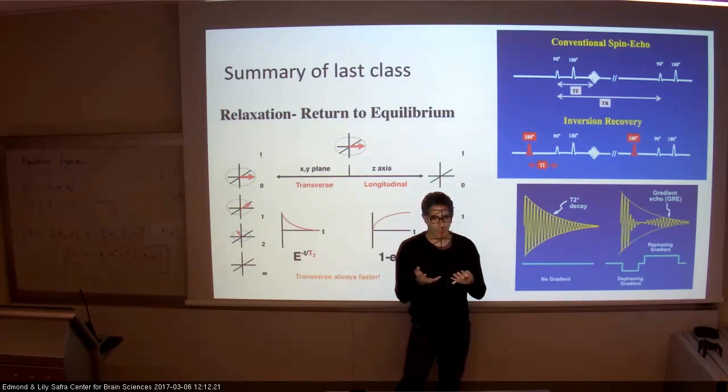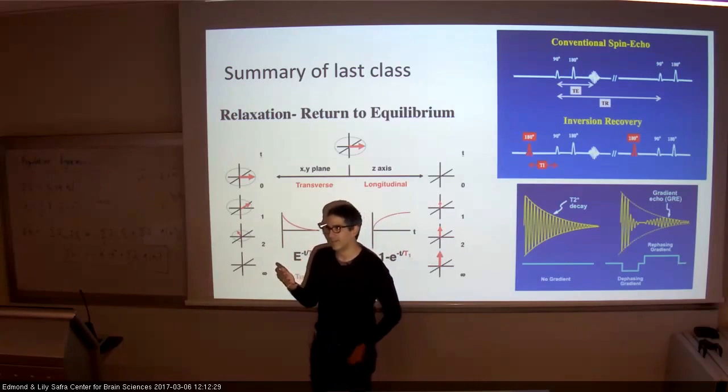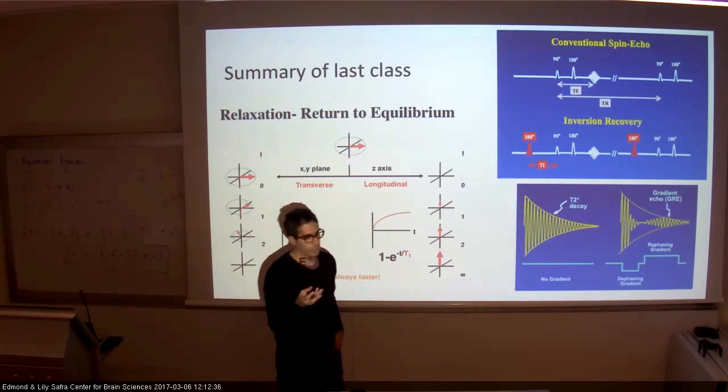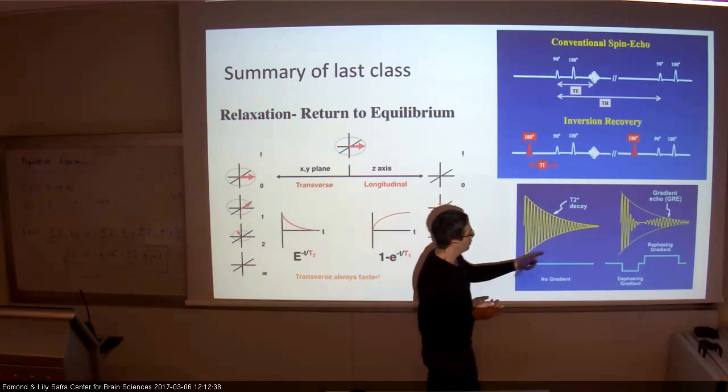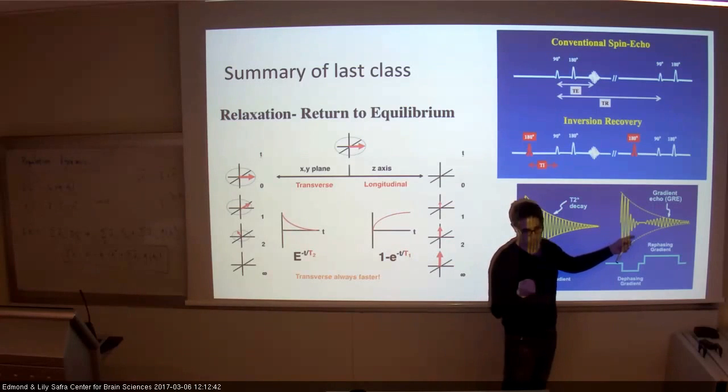For instance, the basal ganglia. In Parkinson's, when the basal ganglia is losing its abilities, there is also an increase in iron, and it's critical to know the amount of iron. So if you want a measurement which is sensitive to iron, gradient echo or T2 star will be really crucial or useful.